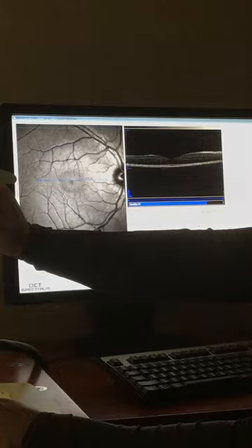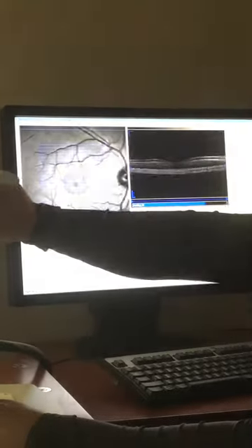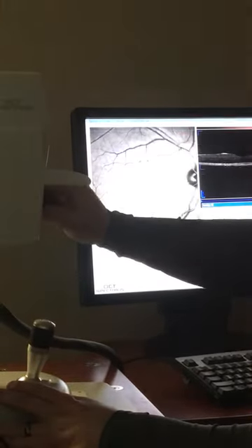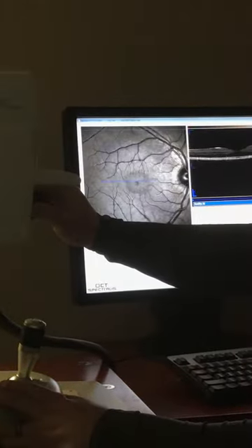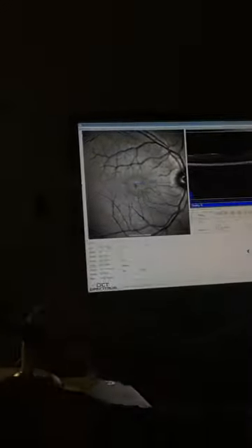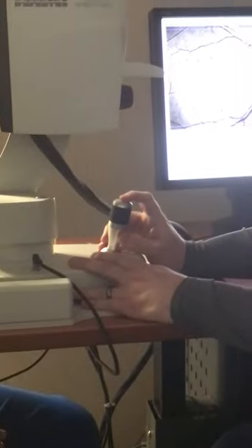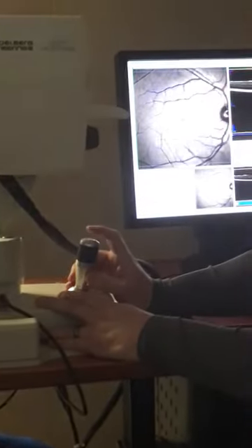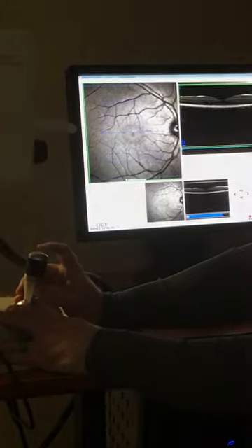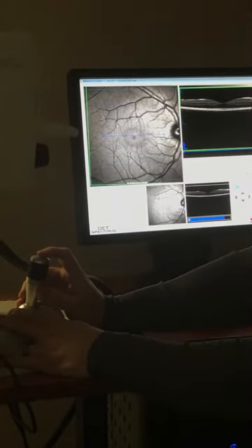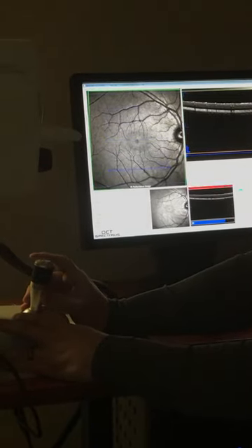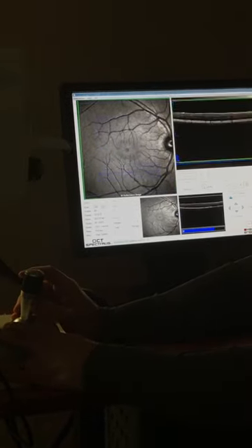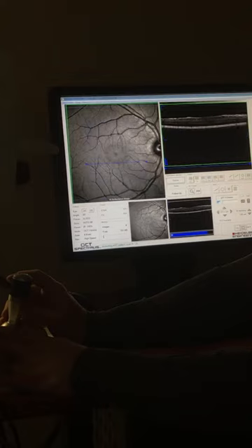This knob here will make the focus in focus or out of focus. Once we're in focus, we're going to use this joystick button. We're going to hold it down first to track it and clear up the image, and then we'll click it again to scan right through the macula.